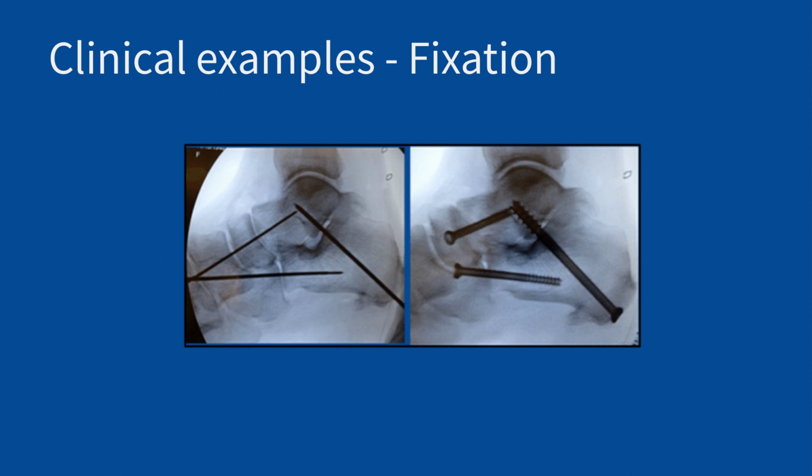Another common use for fluoroscopy, obviously joint fixation, fracture fixation, where you may be using K-wires to get good alignment and then actually place screws, right? Again, you want to make sure that you, on a single view, are confident where you are. It does occur not infrequently that additional joints get penetrated, causing then secondary degenerative changes.